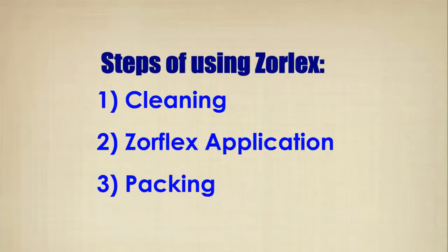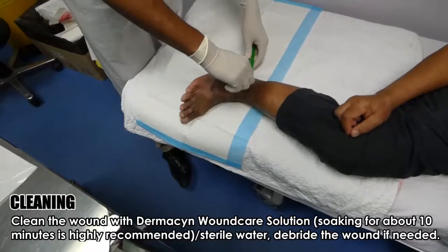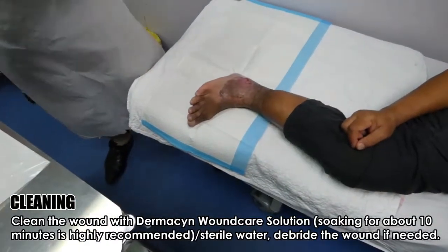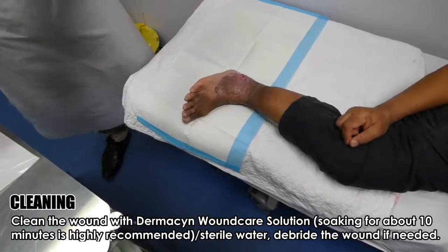Steps of using Zorflex: First, cleaning. Second, Zorflex application. And third, packing. Clean the wound with Dermacyn wound care solution. Soaking for about 10 minutes is highly recommended, or using sterile water. Debride the wound if needed.